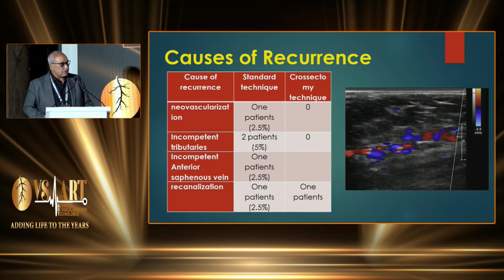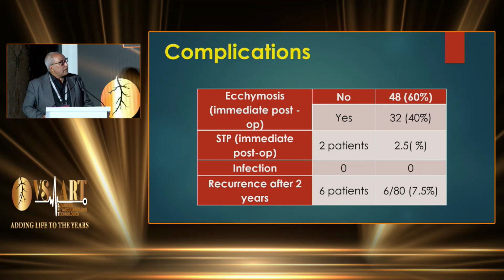This is the neovascularization, shown on the duplex. We don't have major complications other than superficial thrombophlebitis and the recurrence, of course.